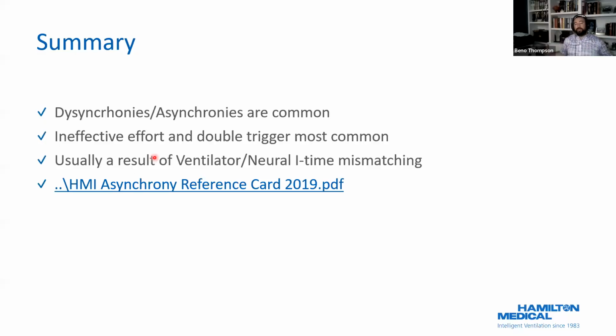So summary, it's important to do this because you need to practice diaphragmatic protective ventilation, right? When your patient wakes up and starts spontaneously breathing, it's your job to figure out what they want and just give it to them. Otherwise, they will destroy their diaphragm trying to get what they want, right? And we're not in the business of harming people. We're in the business of helping people. And if we destroy the diaphragm and have to trach them and send them to rehab, that's doing a fair amount of harm, okay?